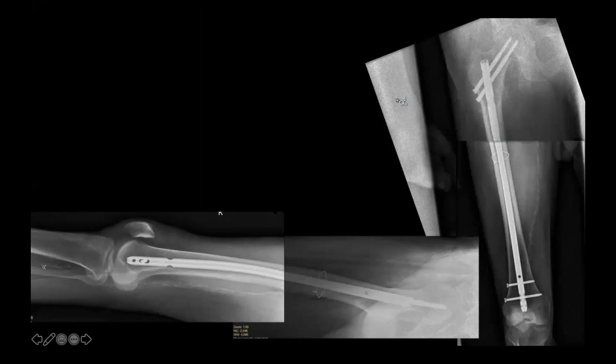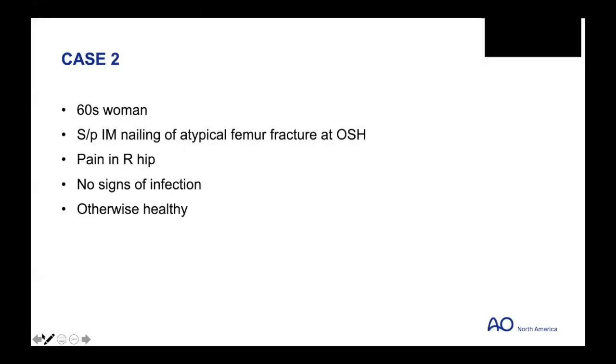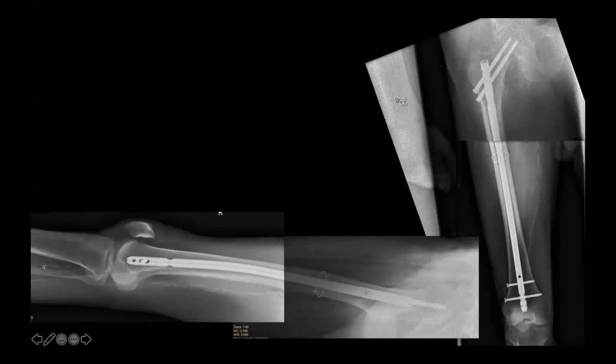There's not much bone in this patient. They're borderline invertebrate. You don't want to leave a big gap where this bone has to bridge from one side to the other. And so in my mind, that makes complete sense, that having this anatomically reduced, I'm certain you've left all the periosteum on there, not stripped anything.